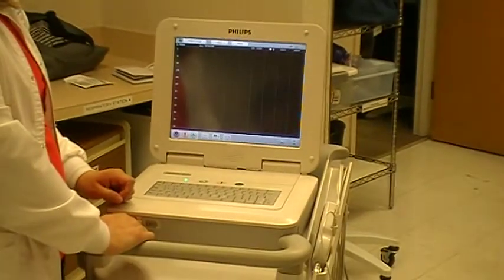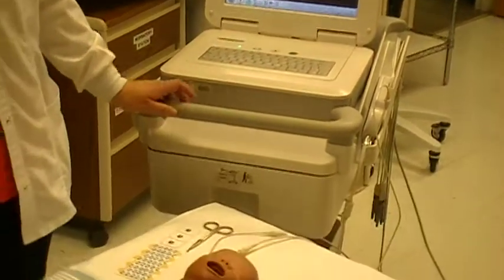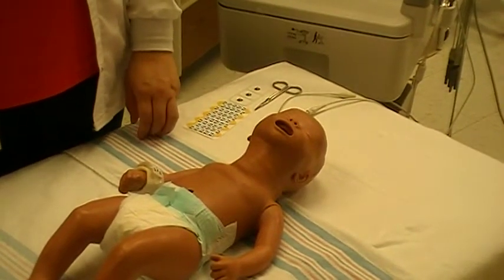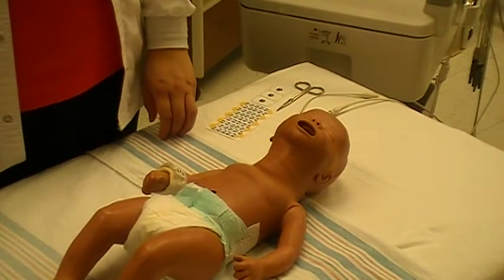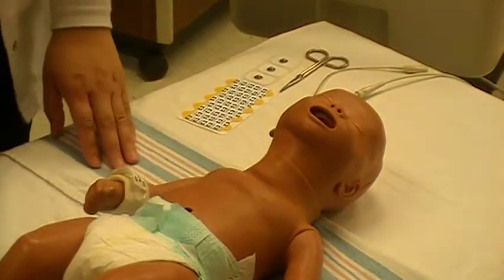Provide for appropriate privacy and position the child comfortably in the supine position. Prepare the sites per the electrode manufacturer's instructions. If the skin is damp or diaphoretic, you can wipe the skin gently with a washcloth.